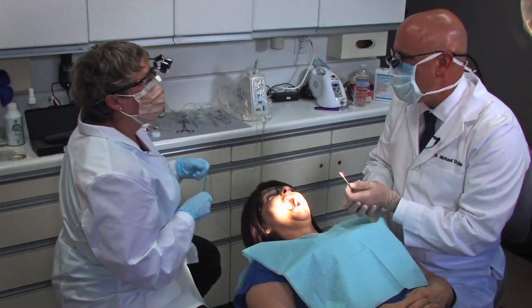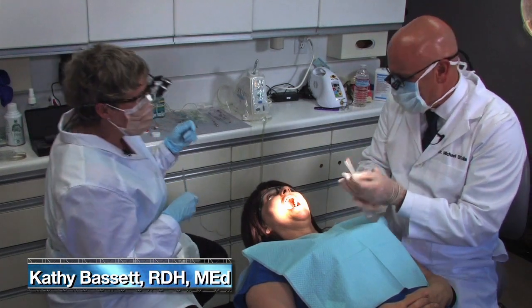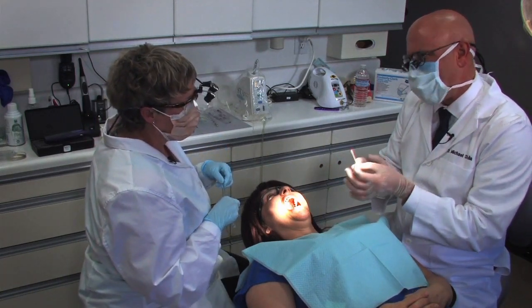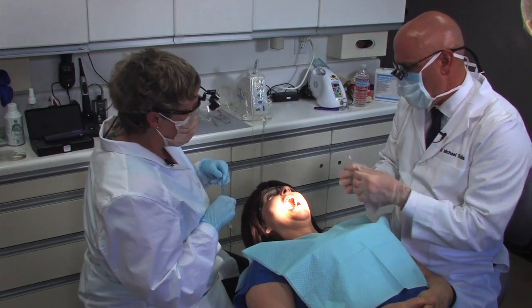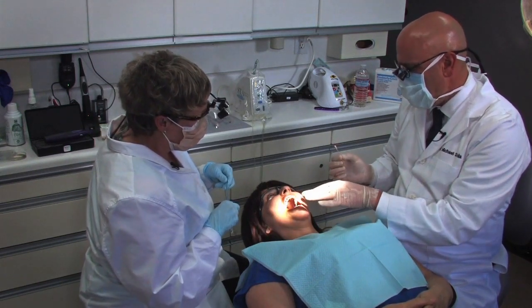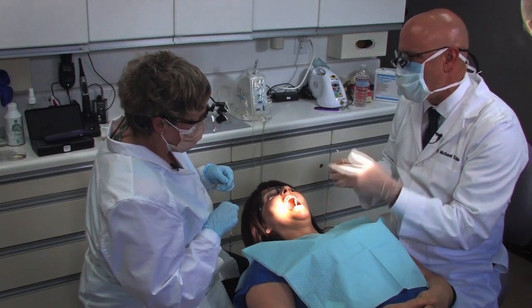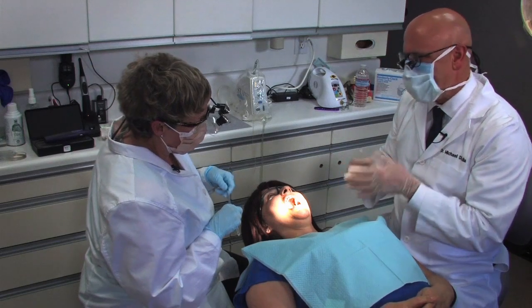The great part about you being here is I get to do another new injection for the first time with your guidance, and you didn't even grab my hand during the Gow-Gates, so that was pretty awesome. This is the AMSA — I honestly hadn't heard of this injection back in dental school. I started hearing about it when I began using the wand STA. For aesthetic dentistry, you can get from second bicuspid to second bicuspid, facial and palatal tissue all anesthetized. Instead of doing 10 infiltrations, you can do an AMSA on both sides — two injections instead of 10.